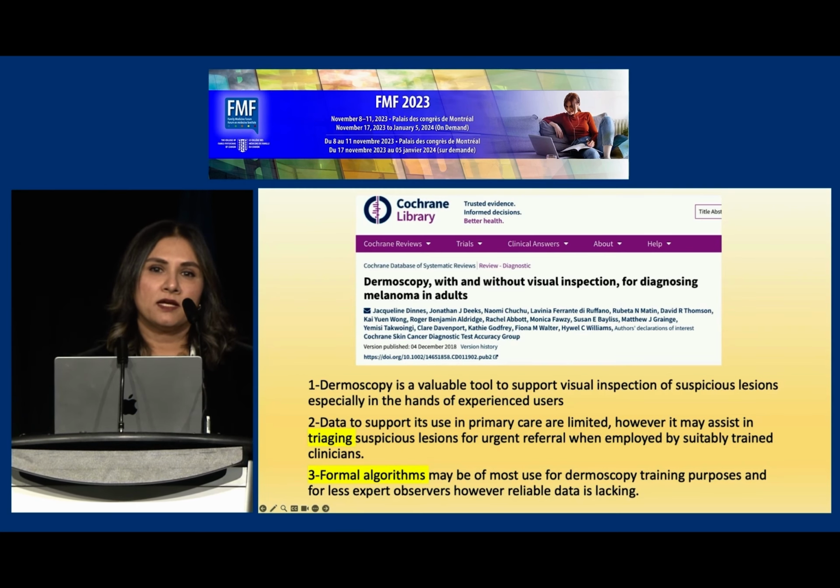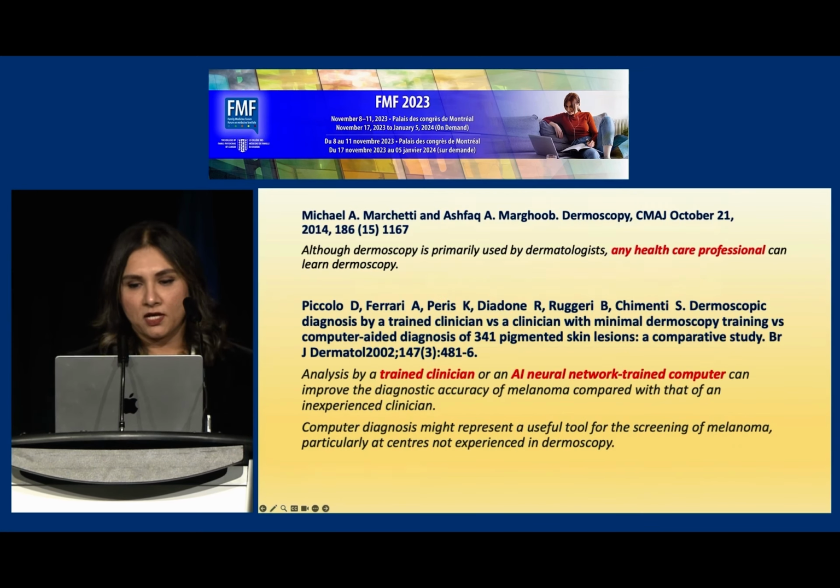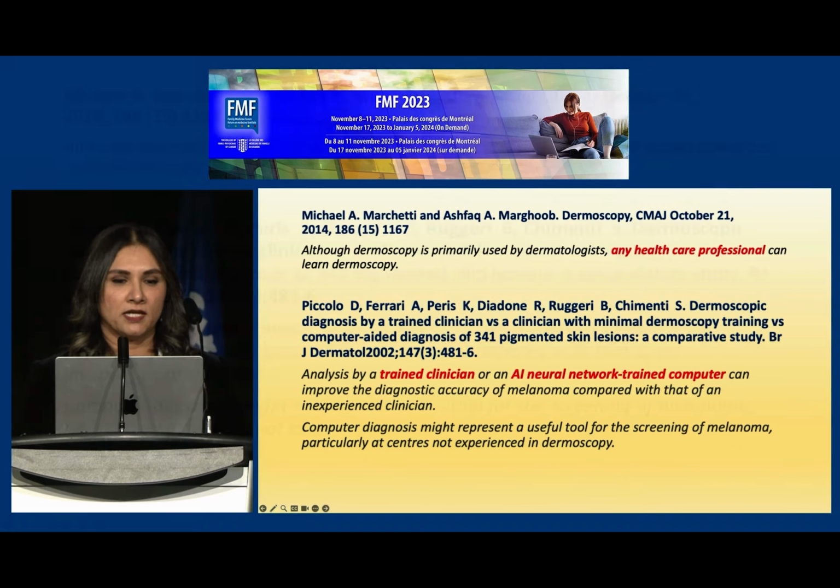And the reason I focused on the triaging is a lot of physicians, again, will ask, why do I need to do this? It's too much work to learn a completely new skill and so on. But I'm hoping that what you will take away from today is the knowledge that to triage pigmented lesions in primary care does not take a lot to learn. And so I think all of us, all family physicians, should be able to use the dermatoscope to at least triage lesions. And obviously, if we have a formal algorithm to follow, it makes learning easier for a hands-on skill like dermoscopy.